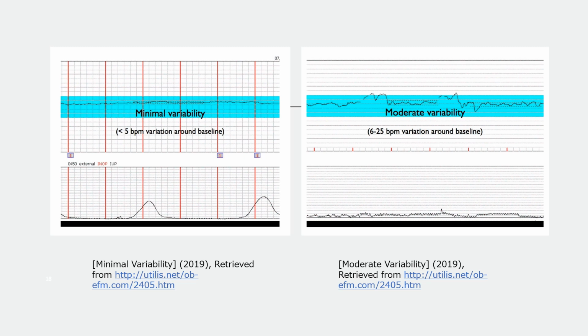Let me give you some examples. If you have a patient come in and they have moderate variability, and then all of a sudden the strip goes to minimal variability and is staying that way, like 20 minutes or so, I'm not that worried because I know the baby is probably in a sleep cycle. Babies asleep have minimal variability. They're not moving very much. So if I know that I've seen moderate variability before this, I'm less concerned about the baby. I know it's a sleep cycle.